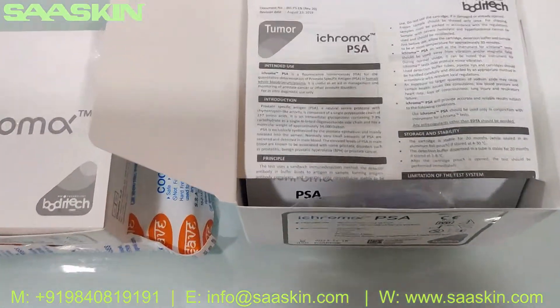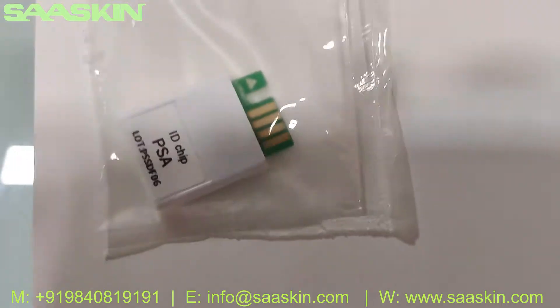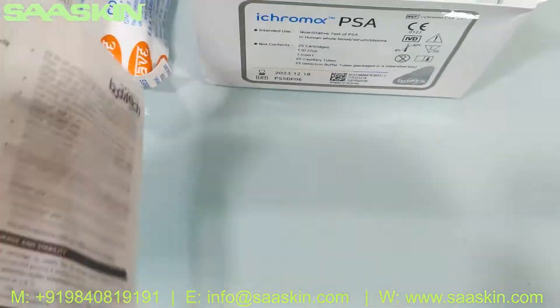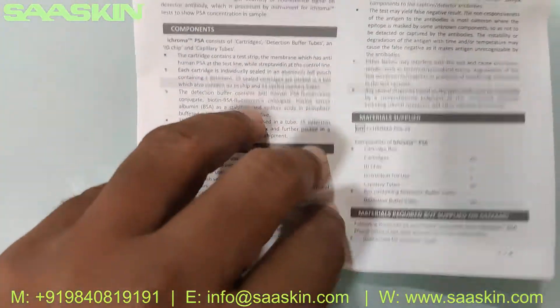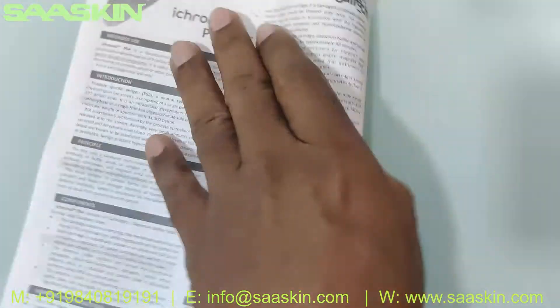If you look inside the box, once you open it you can see there is one ID chip. This ID chip sticks on the inside of the box, and you get one insert — that is the instruction user manual with complete details about the total test procedures, key components, and the limitations of the test.